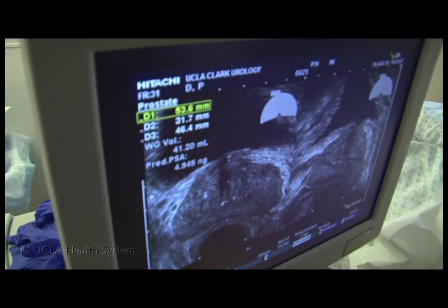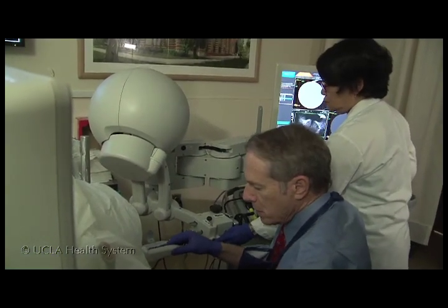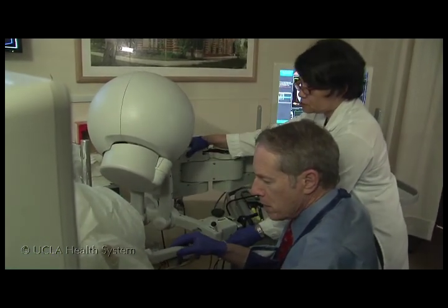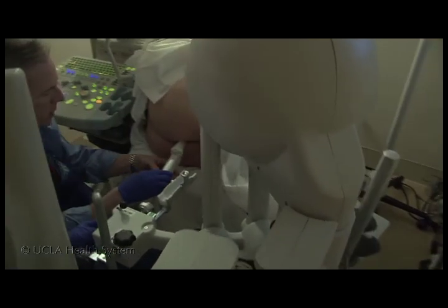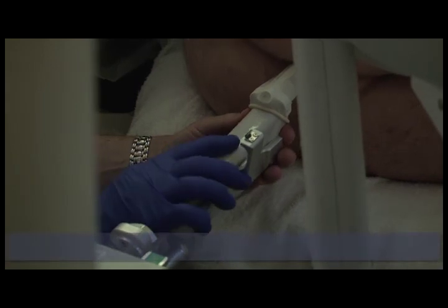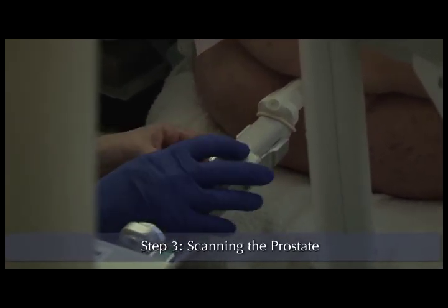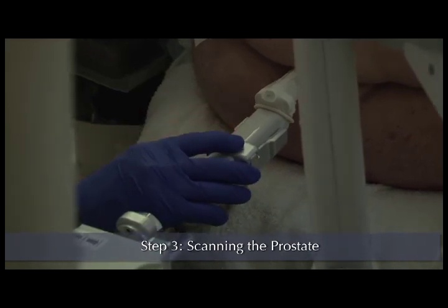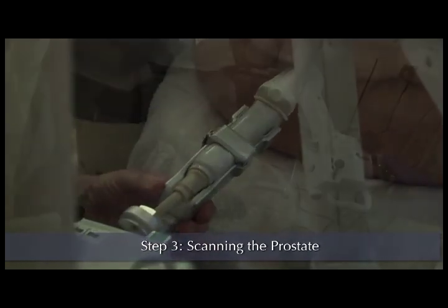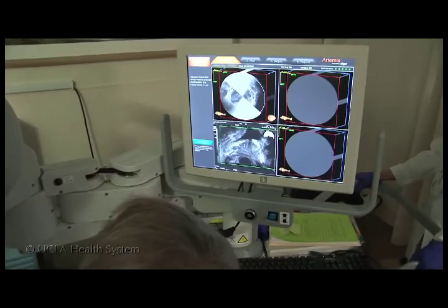The next step in this procedure is to bring the cradle of the ARTEMIS device up into the ultrasound position. To bring the ultrasound probe into the cradle, we try to keep it as horizontal as possible, and a scan of the prostate is then performed by rotating the probe manually across approximately 200 degrees posterior surface of the prostate.